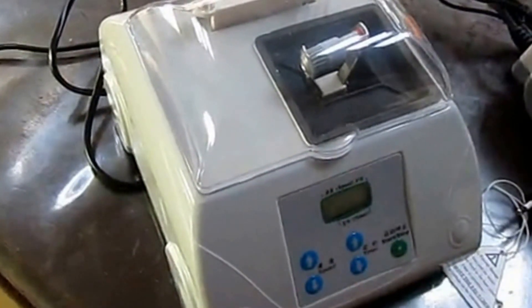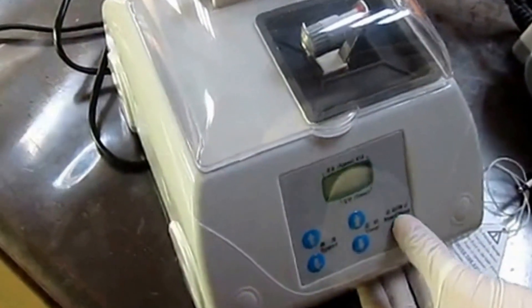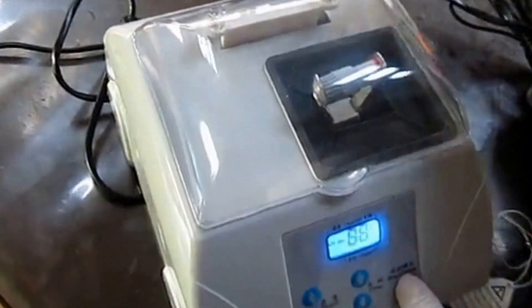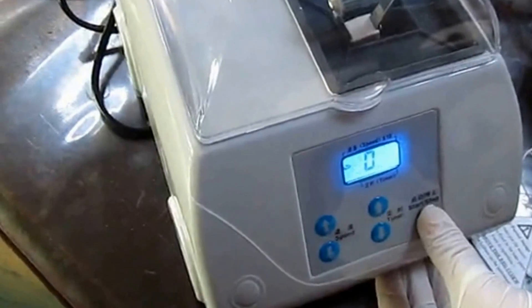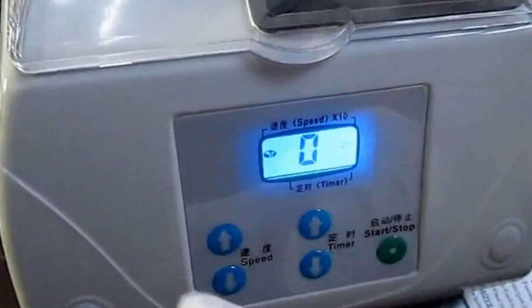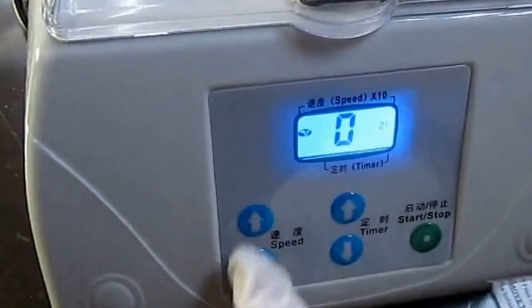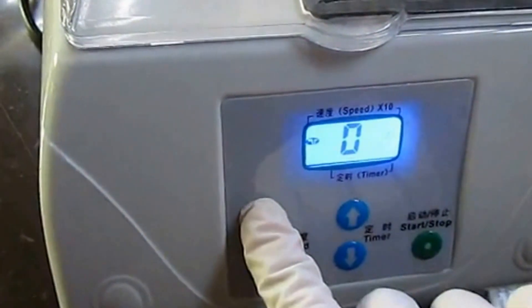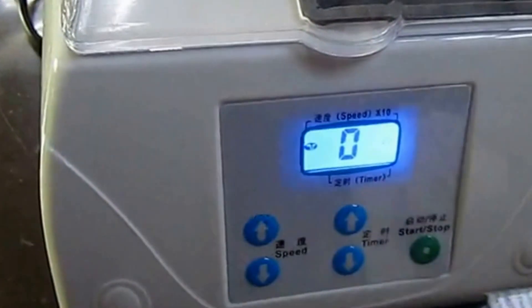In the shutdown state, press the start button and the B switch together. The screen will show O and U. Then press the start button and press speed up to switch from O to U.